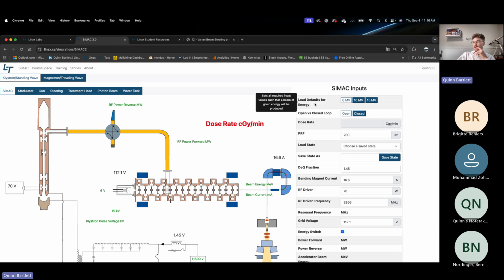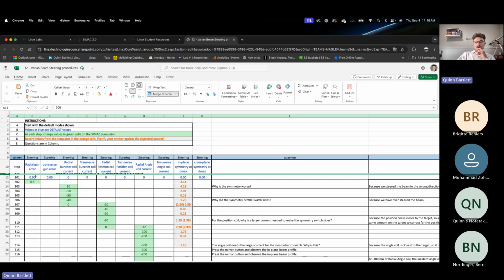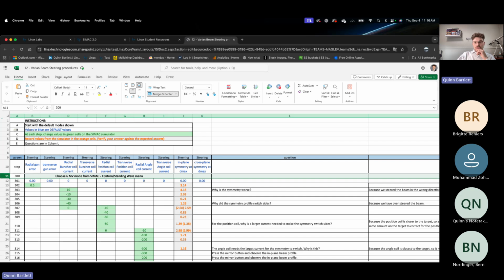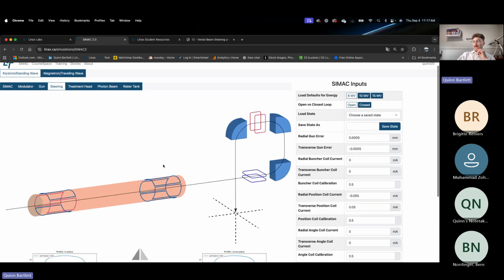And we're choosing a 6MV, so I have my 6MV selected. Then it says values in blue are default values. So of course, these are all the values defaulted in our steering tab.